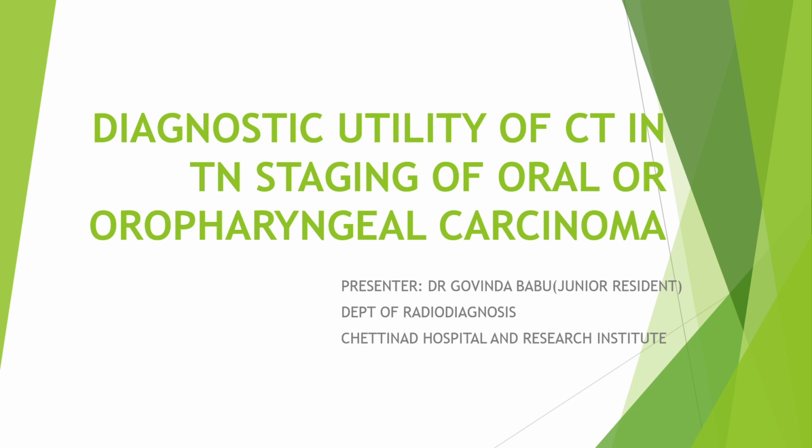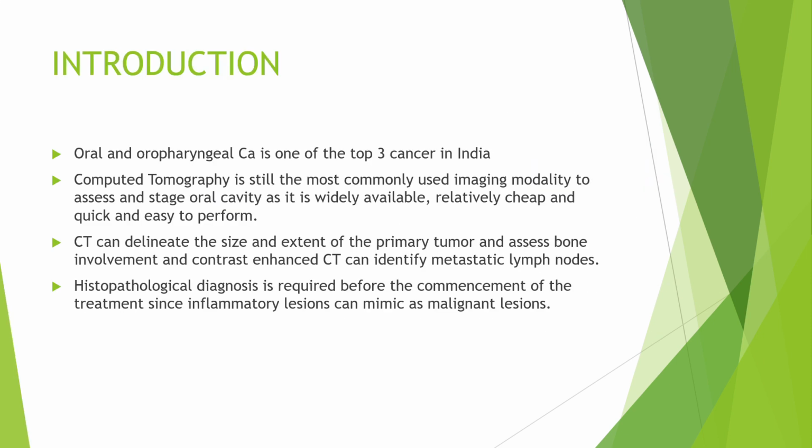Morning. My topic is diagnostic utility of CT in TN staging of oral or oropharyngeal carcinoma. Now we can go to the introduction.